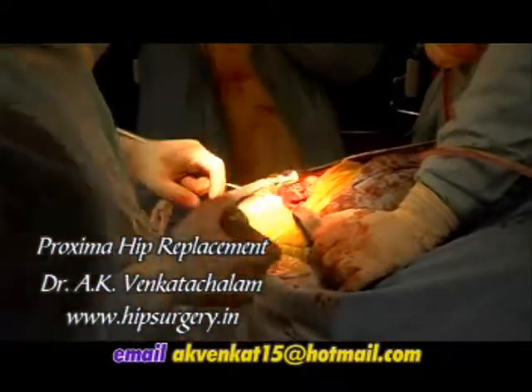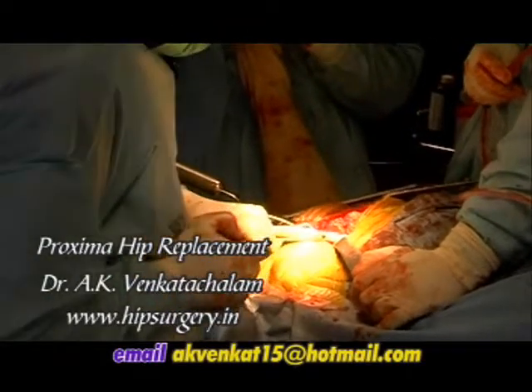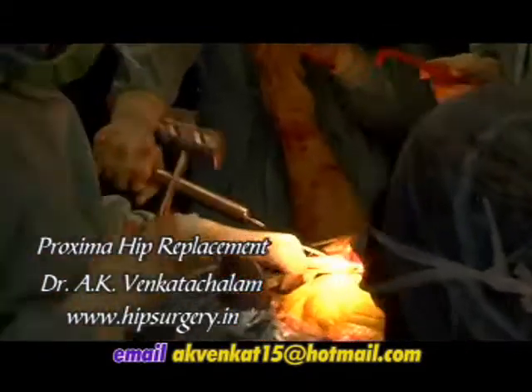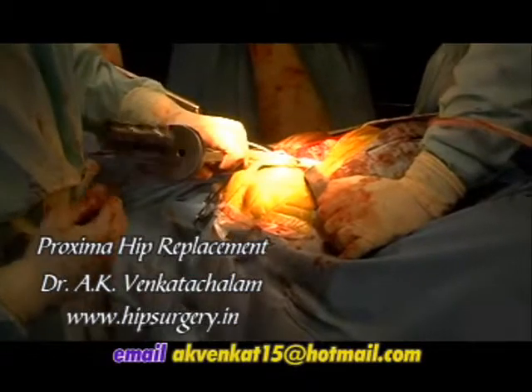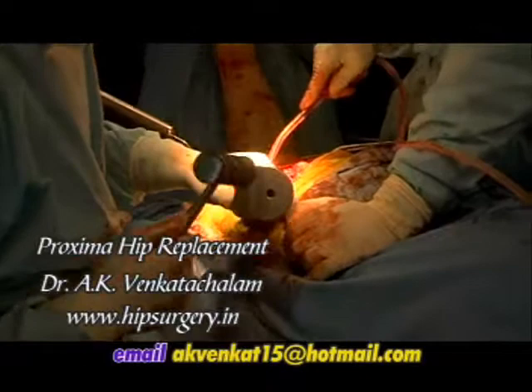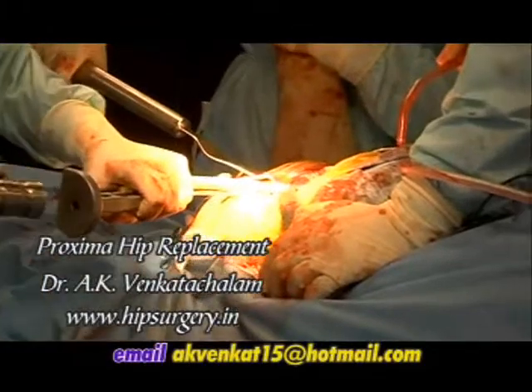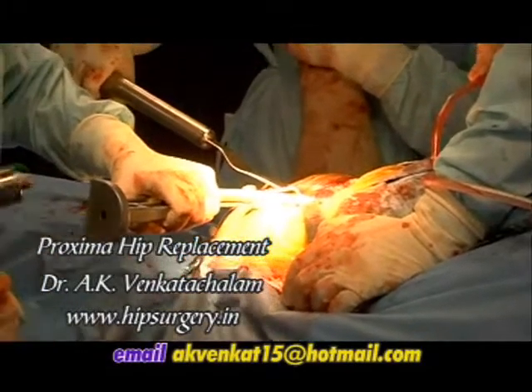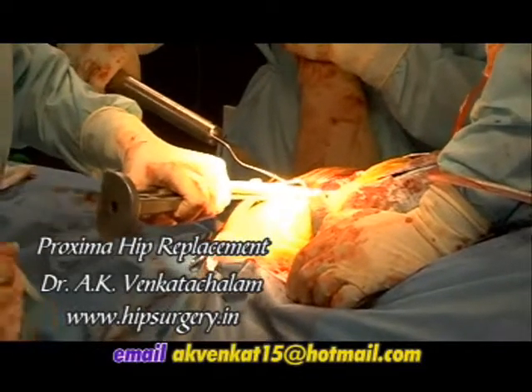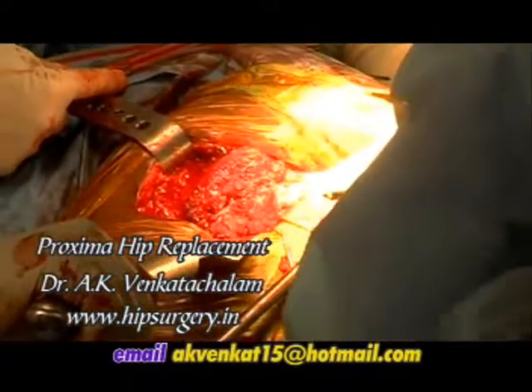The lateral broach, which has no medial teeth, is then used to clear space under the greater trochanter and to develop the broach envelope laterally. The lateral broach should also be brought into a neutral position. Anatomic brooching commences with the smallest appropriate left or right anatomic broach available. Round-the-corner brooching is used to prevent excessive removal of trochanteric bone and allows the broach to follow the natural geometry of the proximal femur in both the AP and medial-lateral planes.